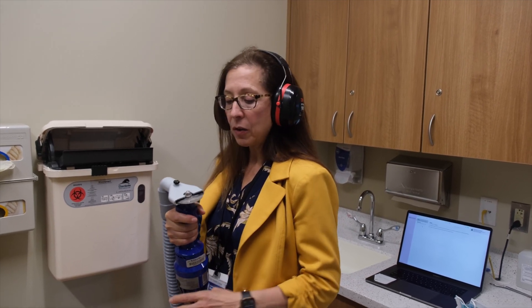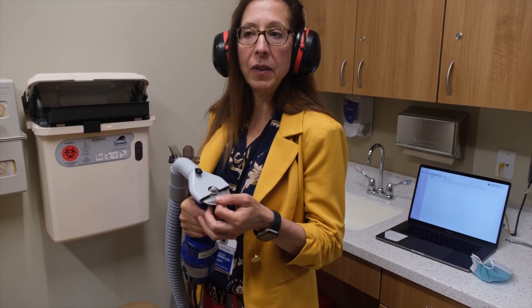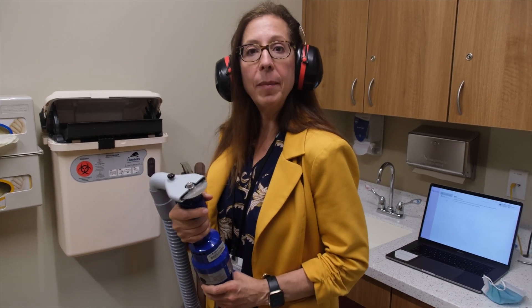We're going to use a cast cutter to take off casts. The cast cutter looks like it turns in a circle, but it doesn't. It just shakes and it tickles when you take the cast off because of the vibrations. So here, let me show you.